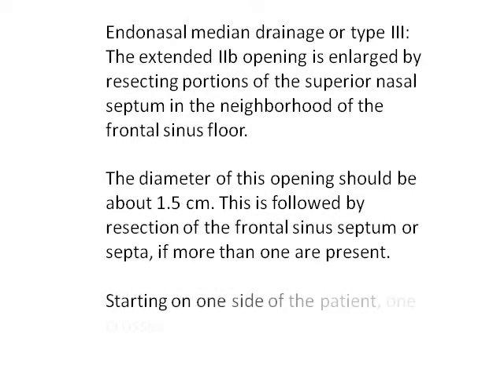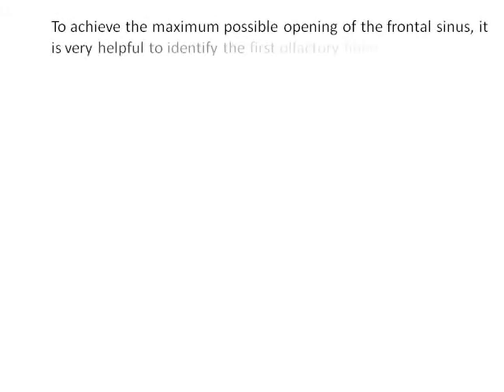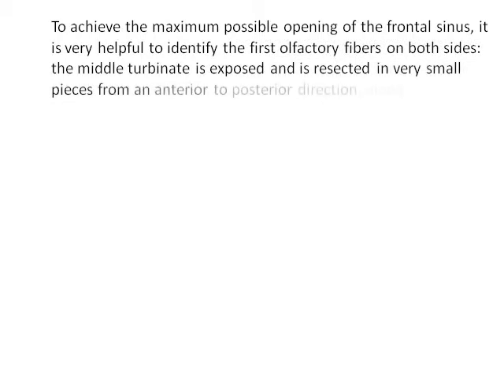Starting on one side of the patient, one crosses the midline until the contralateral lamina papyracea is reached. To achieve the maximum possible opening of the frontal sinus, it is helpful to identify the olfactory fibers on both sides. The middle turbinate is exposed and is resected in very small pieces from anterior to posterior along its origin at the skull base.